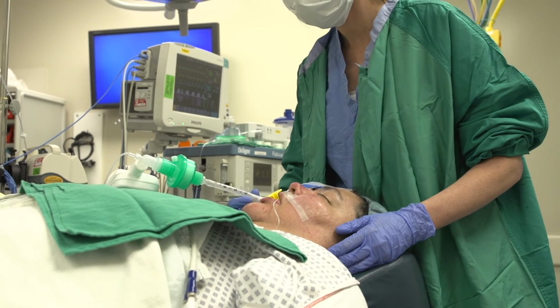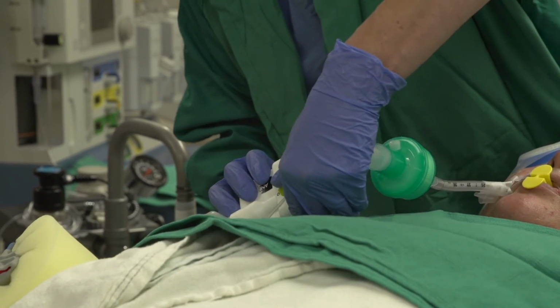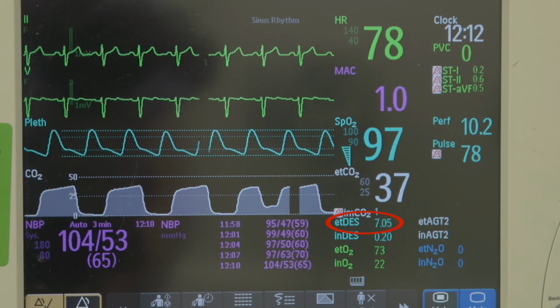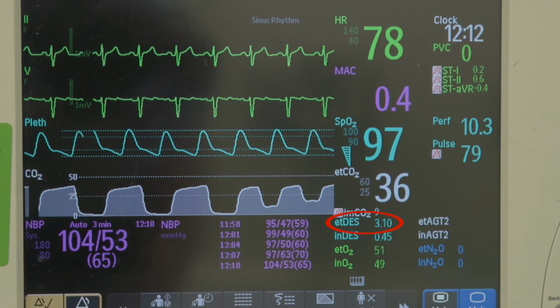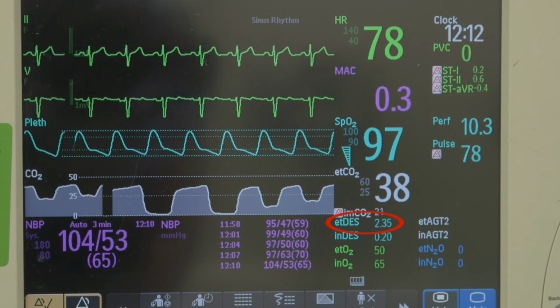Continue to monitor the patient for the classic signs of emergence from inhaled anesthesia. After ANEclear activation, the displayed fraction of inspired agent will quickly decrease to near zero. The end tidal agent level, while never reaching zero due to the agent being steadily eliminated by the patient through expiration, will rapidly decrease to less than MAC awake levels due to its active clearance by ANEclear.